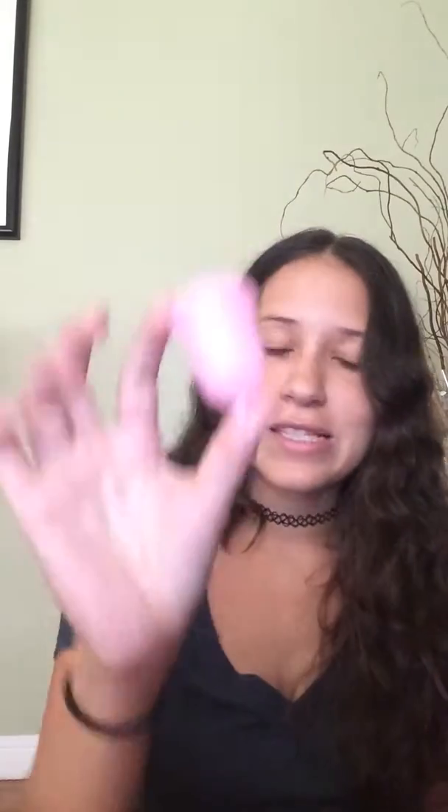This product is sold online on Amazon, and it is sold for $16.99. This is the Menstrual Cup.